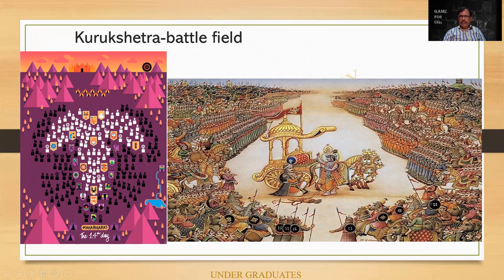So in an army, there will be different kinds of soldiers: on horses, on foot, on camels, etc. And there will also be a different distribution of this army. In some areas, it has a bird-like outline or configuration. Sometimes it will have a configuration of convergence. That is what I wanted you people to appreciate. Now, what is this explanation meaning in today's context?